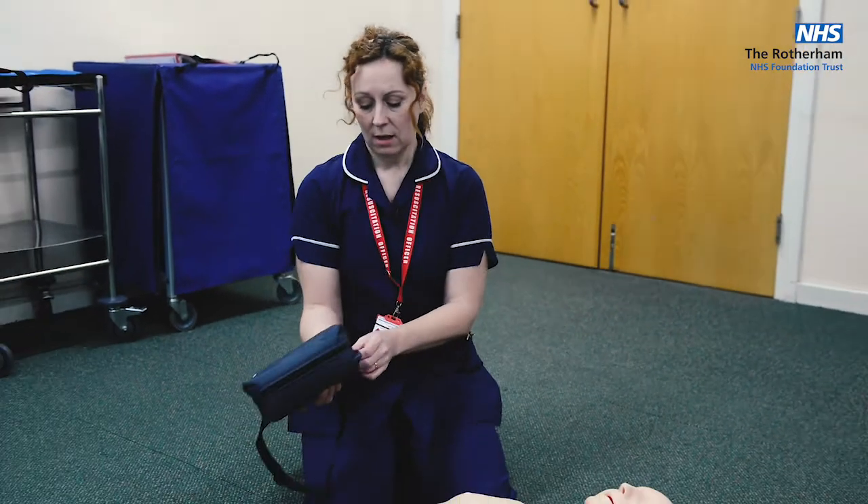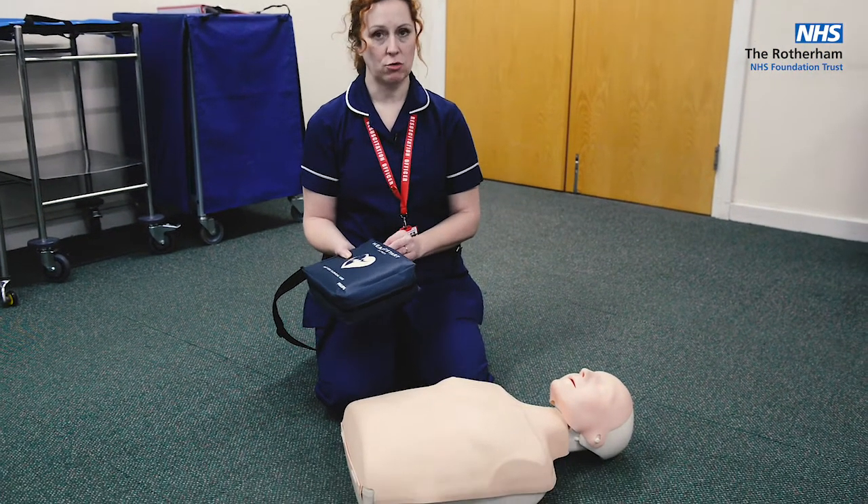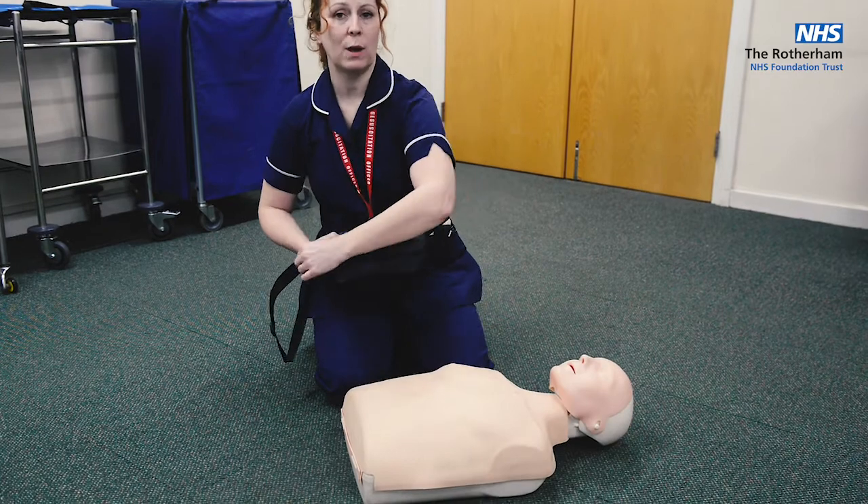In the community, AEDs may look different to this one. This is the one we use in the trust, but they all work pretty much the same way once they are turned on.